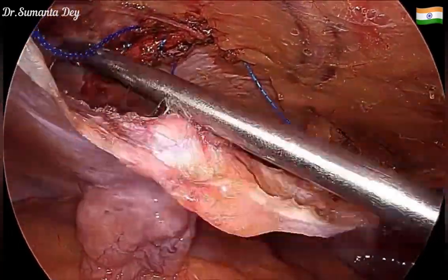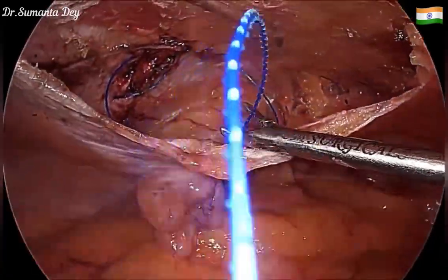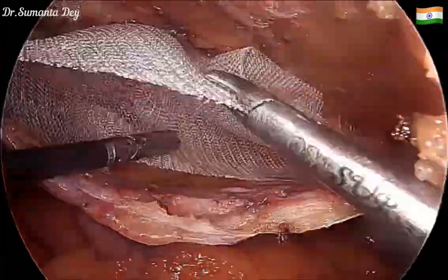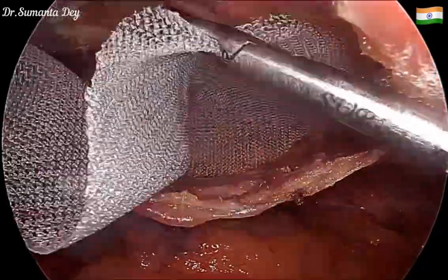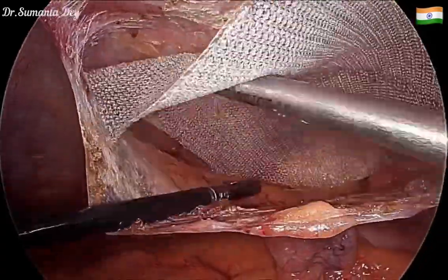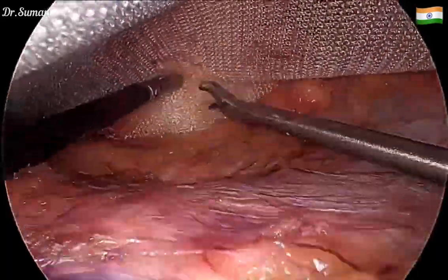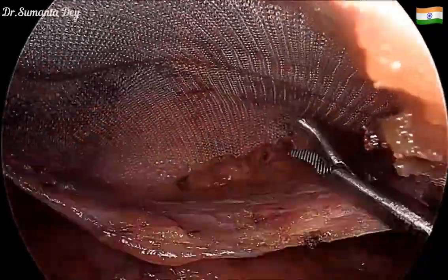Once the defect is nicely closed, I'll be placing the mesh in the preperitoneal plane. This is a medium-weight regular polypropylene mesh — a flat sheet. Once placed inside and unfolded, it takes the area nicely and should lie flat. If the area of dissection is adequate, the mesh sits flat in the preperitoneal plane, and you can see it is sitting nicely.